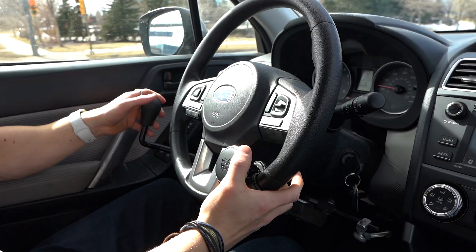I got the steering knob on Amazon for like 20 bucks — nothing too crazy. The hand controls themselves were expensive though — about a thousand dollars, which includes installation fees. That's a lot of money, but it's really nice, it's lasted me many years, and it's mounted to the steering wheel column overall very nicely.